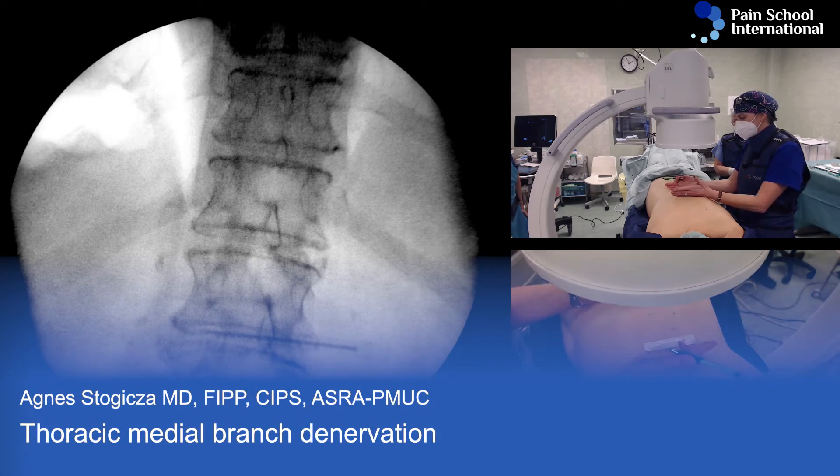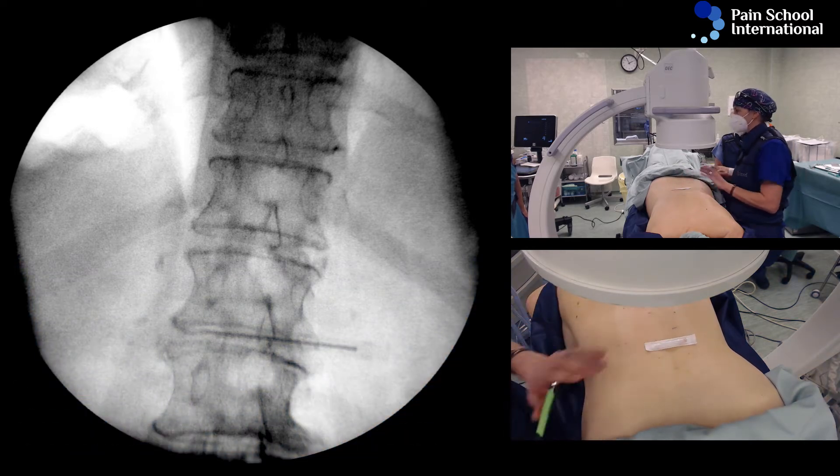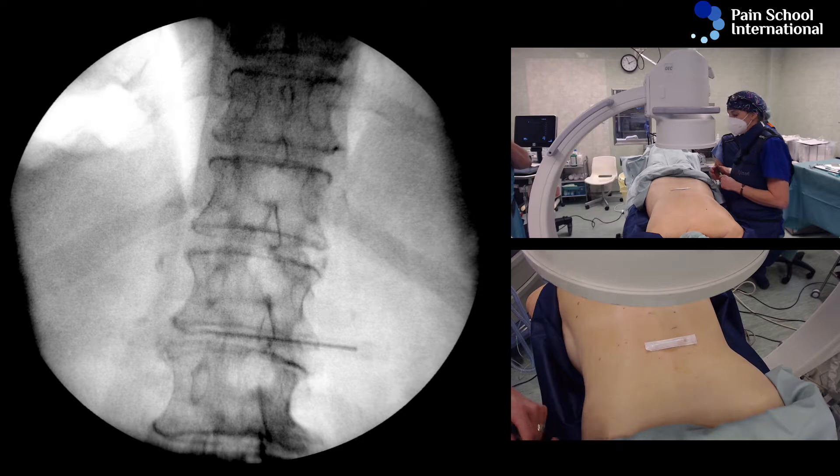This is the physical exam done before a diagnostic block. This patient already had a positive diagnostic block, hence we are proceeding with radiofrequency ablation.